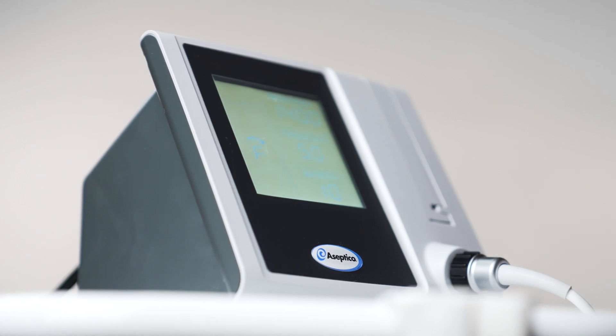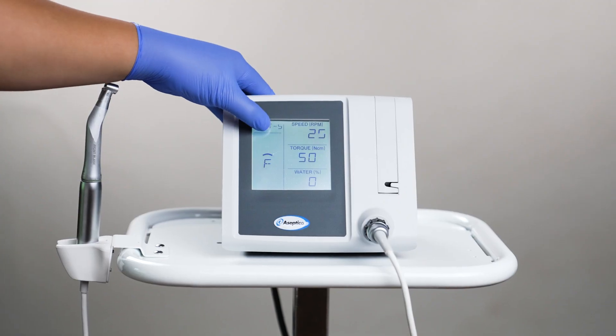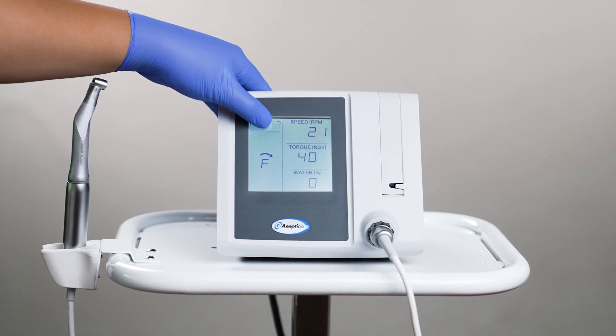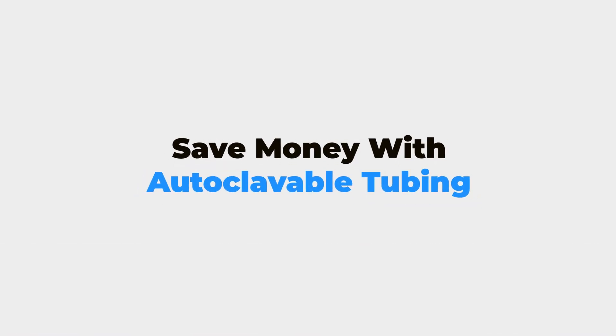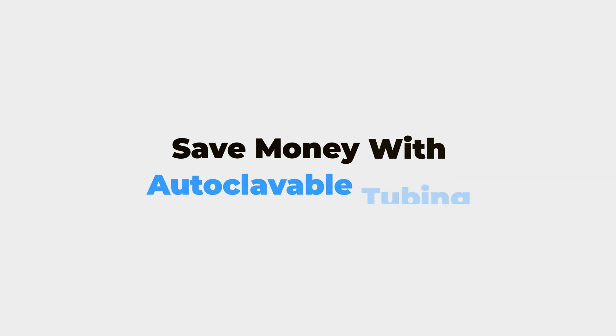The AEU 1070's compact footprint and water-resistant chassis design takes up little countertop space and makes it easy to disinfect. The Asseptico 1070 has eight programmable presets for customization around preferred techniques. The system also includes autoclavable irrigation tubing that saves you money compared to single-use disposable tubing.